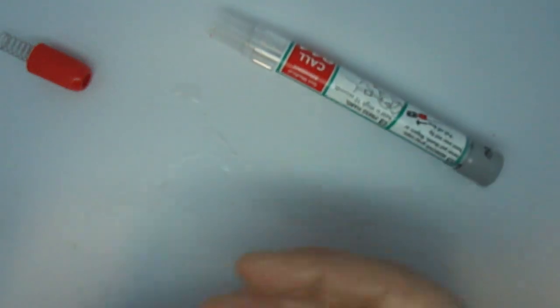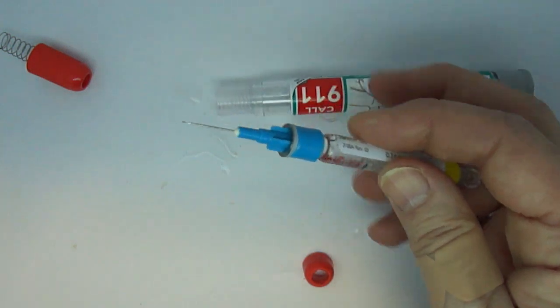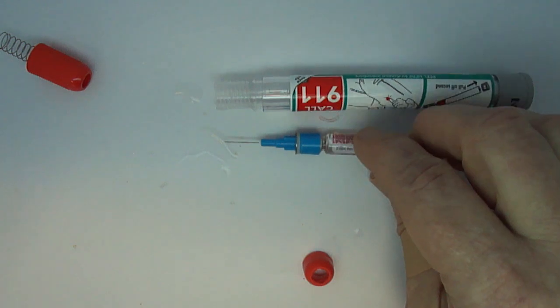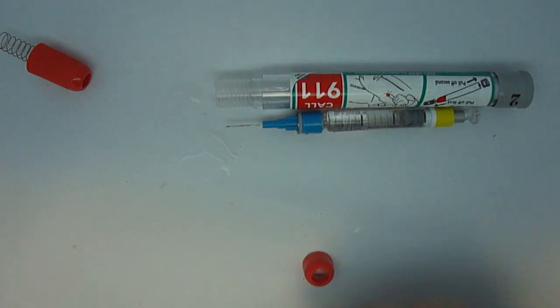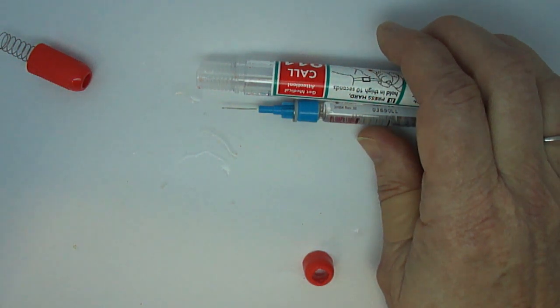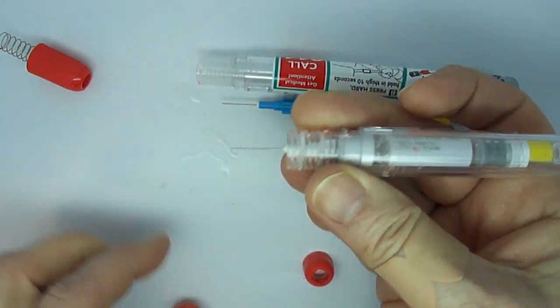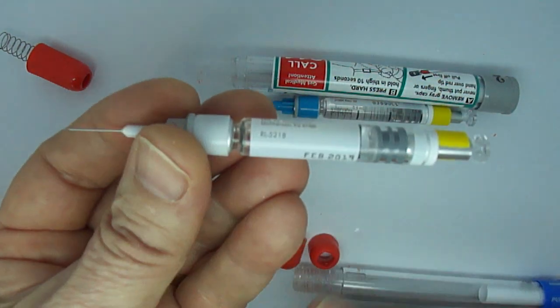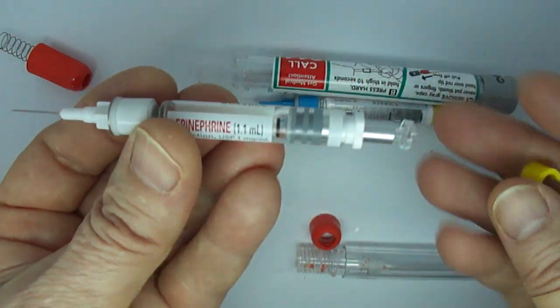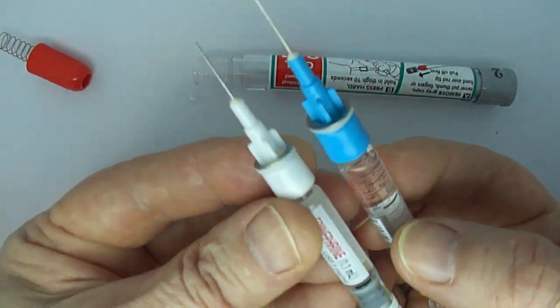Really looks quite identical if you compare the older versus the newer version, which I've now let disappear on my table. And then the newer version, which is here, they've made some very minor changes. So it no longer has the markings, and it has different colors, but it otherwise is a really similar vial and needle.